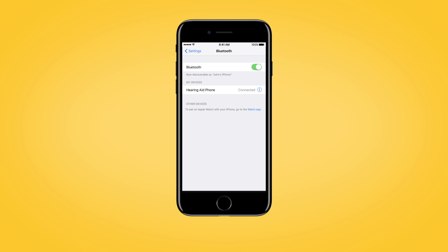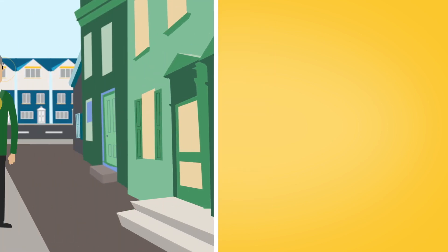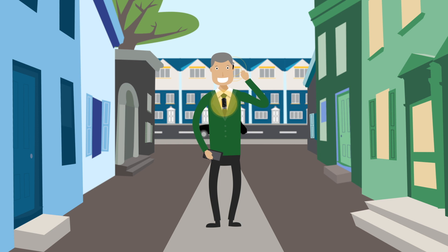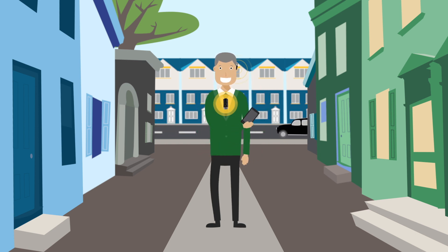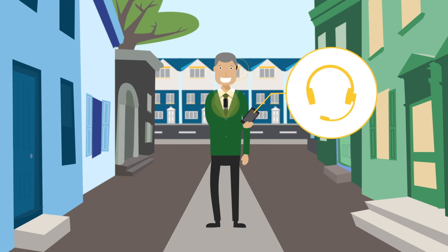If your mobile phone asks for a passcode, enter four zeros. Your phone clip should now be paired with your mobile phone. If your mobile phone asks which Bluetooth service you wish to enable, select Headset.